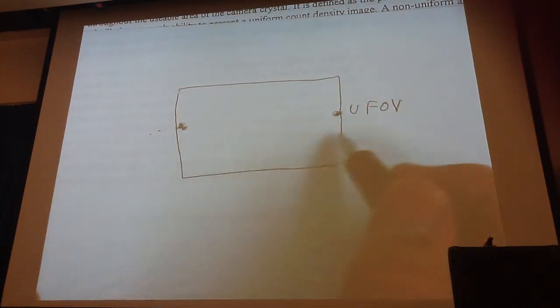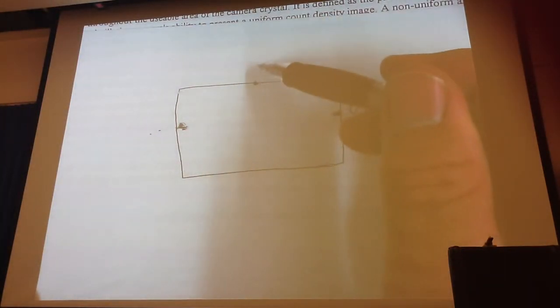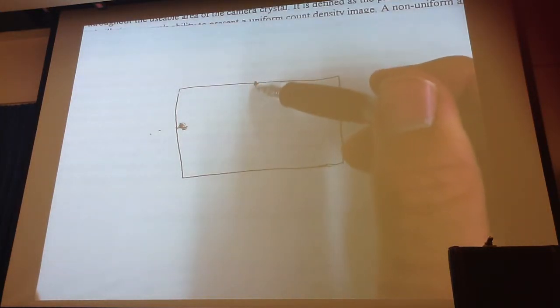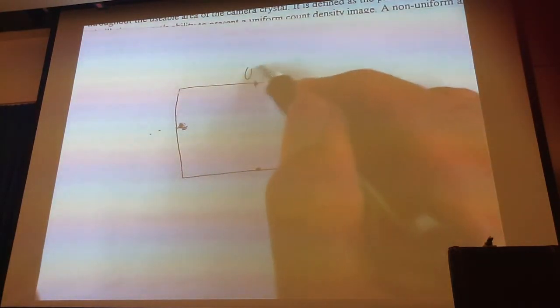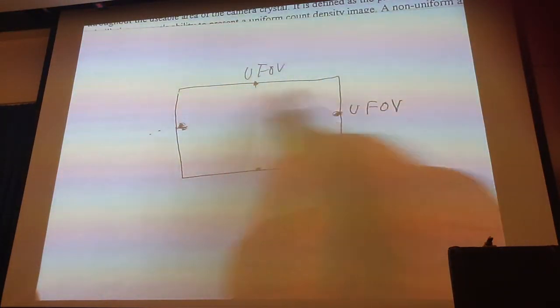And you do it in the horizontal and the vertical dimension. So you understand that? Get some radiation, like a little cobalt source, and then you just measure the distance where you can see it on your persistence scope. Okay? So that's your useful field of view. Central field of view is 80% of this.